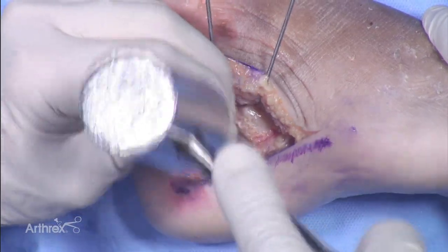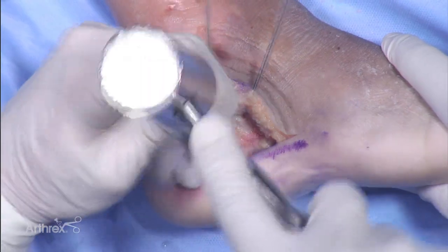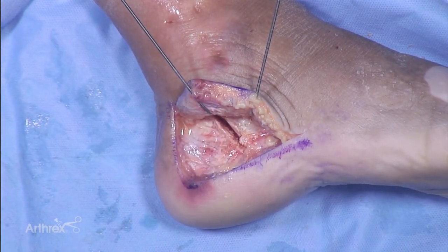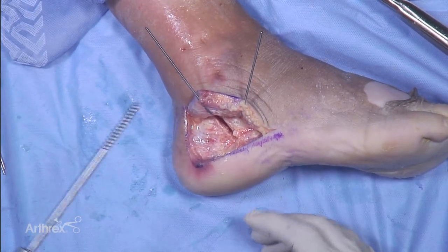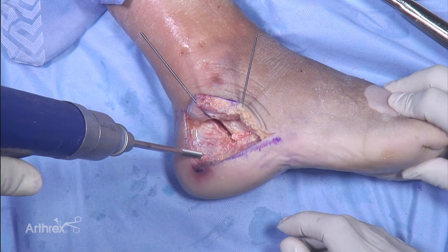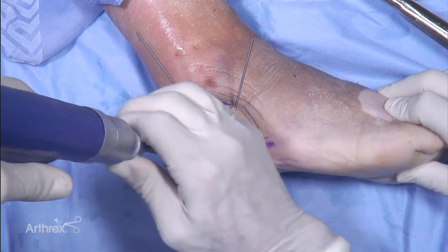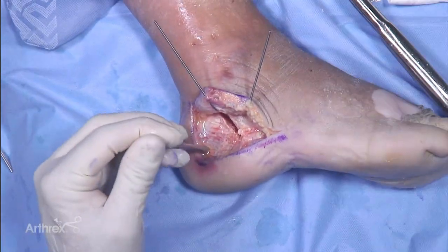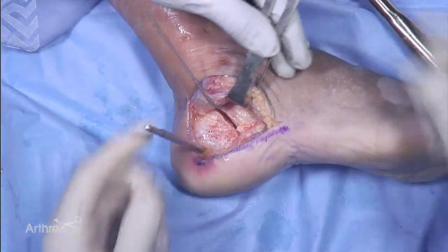We'll go ahead and make a calcaneal fracture — oftentimes with the bone we'll have bone deficits. One trick I often use is to place a Steinmann pin in the posterior body to get control and lever the fragment down for better visualization of the joint surface. This gives a really nice joystick to pull it down, opening up the fracture site and helping lever down to see the subtalar joint very nicely.